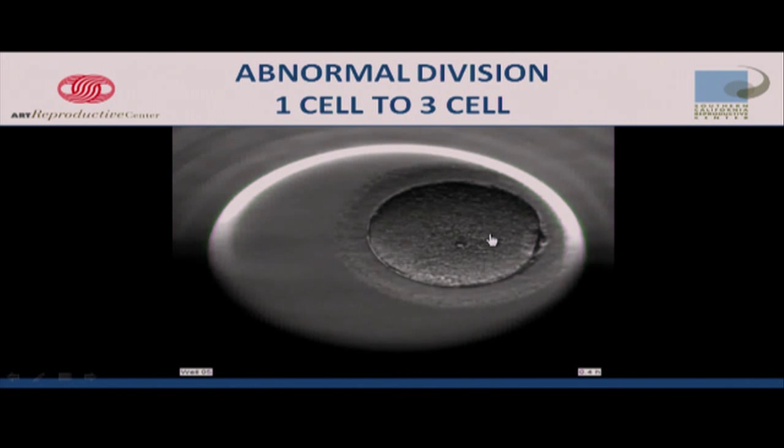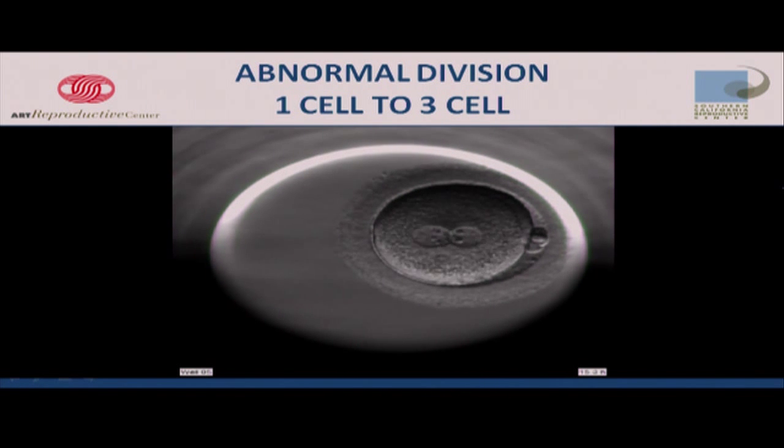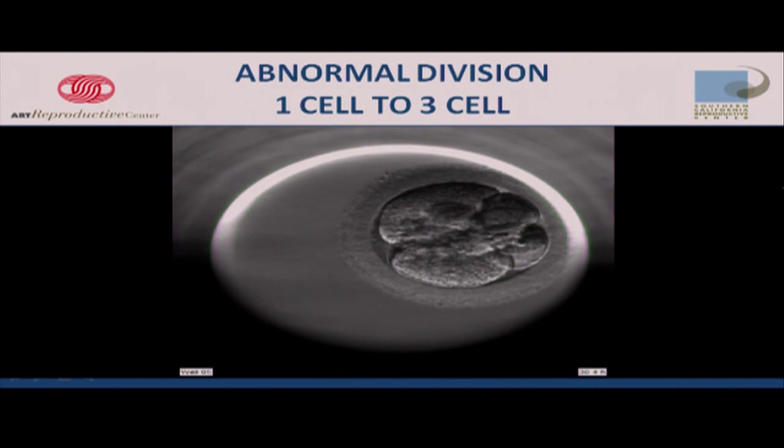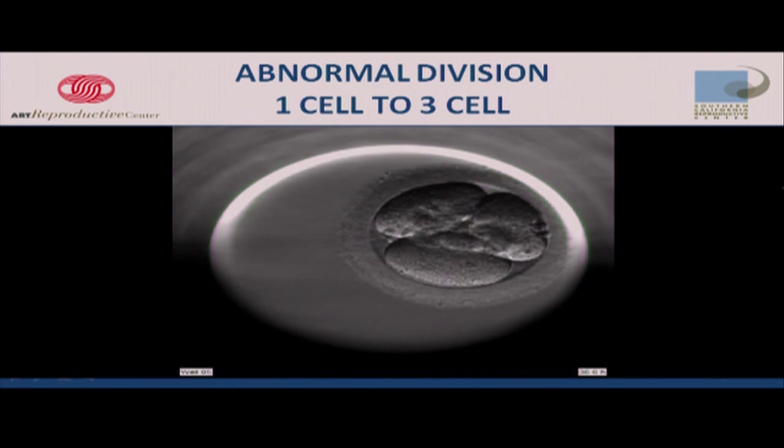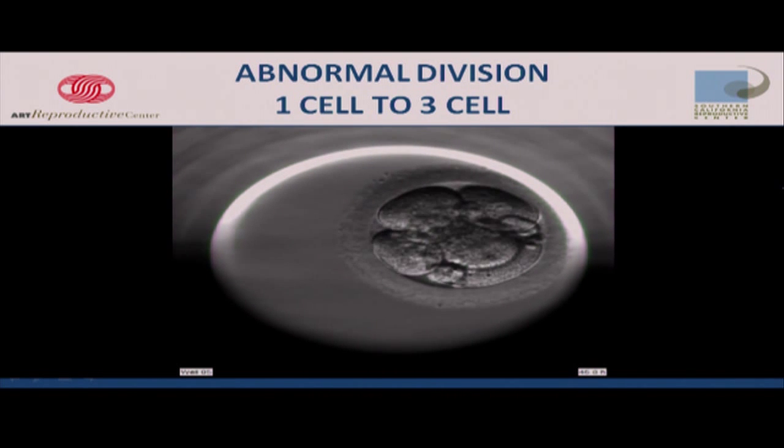So in this embryo we're going to watch, go ahead, Kevin, thank you. You go from 1 cell, 2 pronuclei develop. We knew it was normal. And then all of a sudden, it gets crazy. It doesn't know what to do. It's wobbling around. Who's who? What do we want to touch? Who's going to be together? And we end up with 3 cells at that stage.